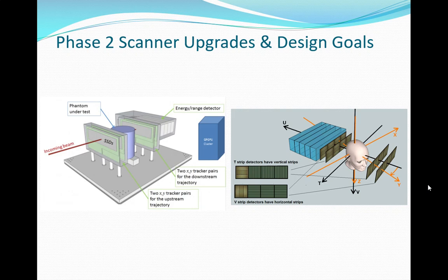I'll explain some of the issues that come in. Essentially, we're going to have two trackers. Think printed circuit boards that we just print traces on, one side going horizontally and the other side vertically. And we have a very precise pitch to them. Right? So that any time a proton passes through the metal, you get a tiny, tiny current as it goes through because it interacts with the electric field. An electron gets knocked off the metal. You take that tiny, tiny current and you detect it: I got hit. Right? So that's basically how it works. Yes, you can miss it.